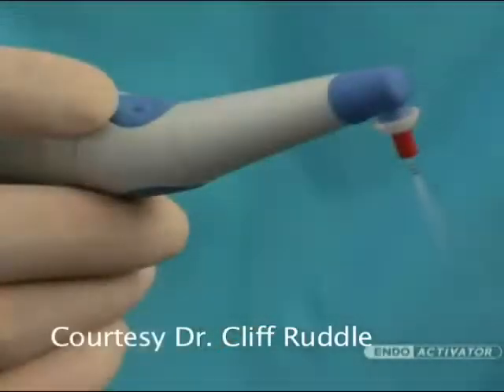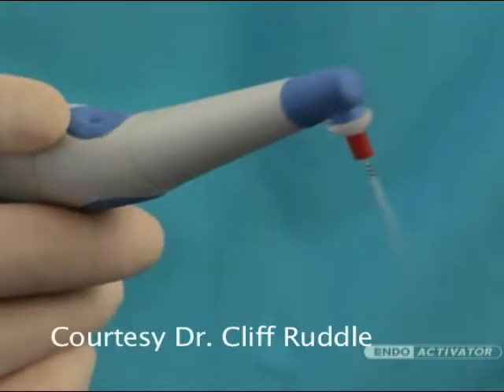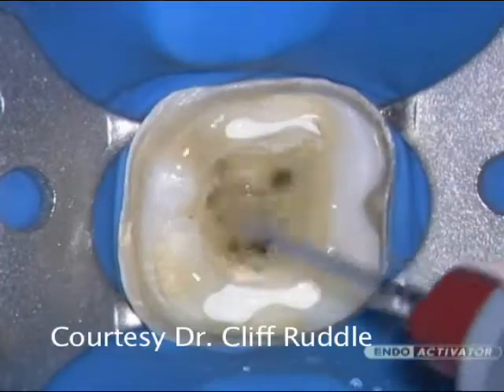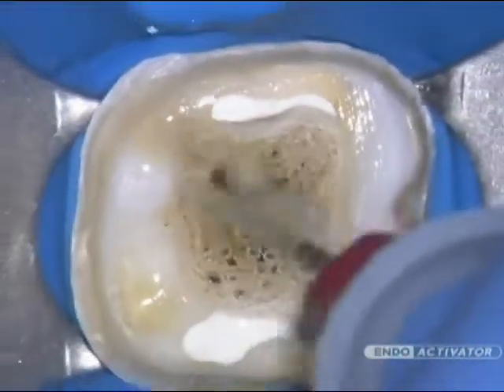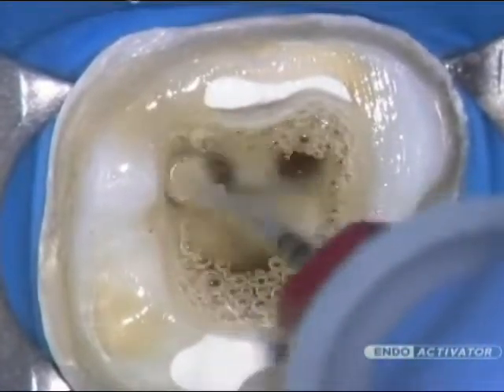The Indo-Activator system uses strong and highly flexible polymer tips to safely activate various intracanal reagents and vigorously produce the hydrodynamic phenomenon. This new technology provides an advantage over traditional methods and offers a safer, better, and faster way to achieve success in the following clinical applications.